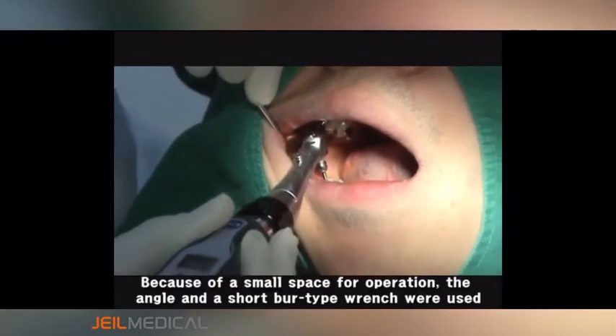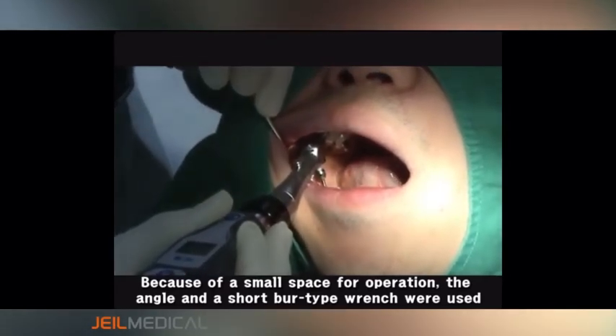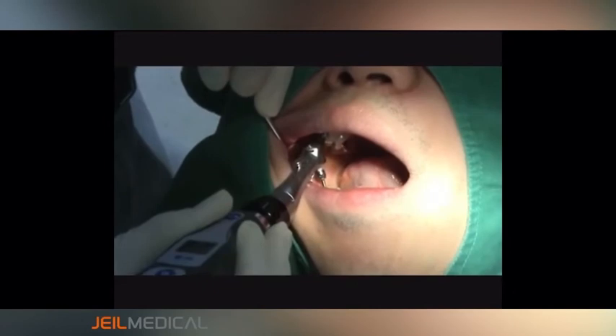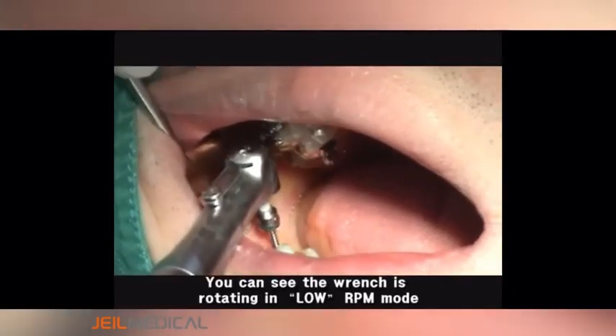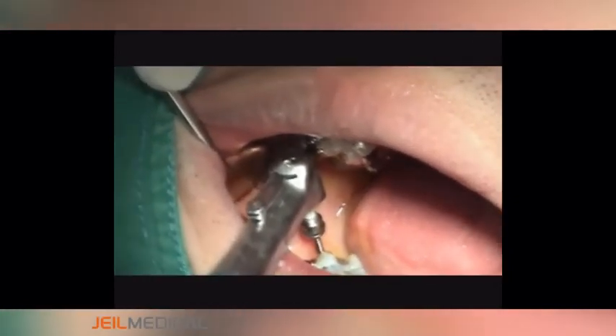Because of the small space for operation, the angle and a short bur-type wrench were used. You can see the wrench is rotating in low RPM mode.